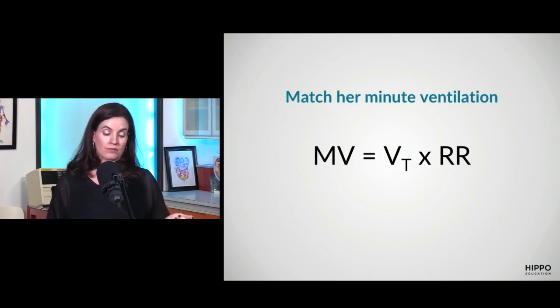I don't normally calculate the resp rate myself pretty much ever, except for these patients. If I am going to intubate somebody with severe metabolic acidosis, while the nurses are getting the meds ready and the RTs are getting their tube ready, I am standing at the end of the bed with my watch, personally counting their resp rate, because I want to either match that rate or exceed it a little bit. And I'm thinking about their tidal volume. How big a person are they? Are they taking giant breaths and using all their intercostal muscles?